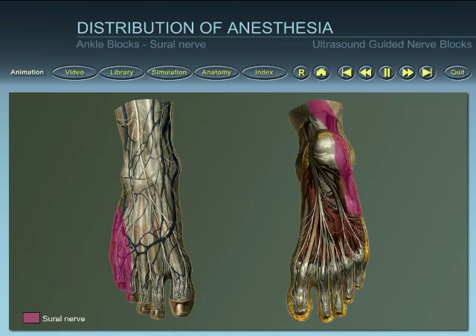For the sural nerve, anesthesia is provided to the lateral part of the dorsum of the foot, including the fifth toe.